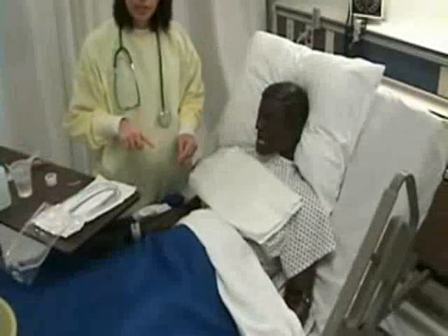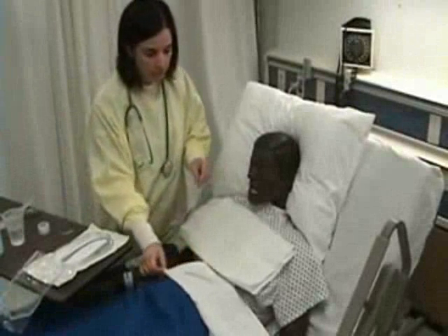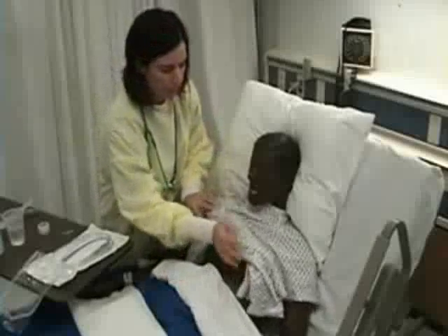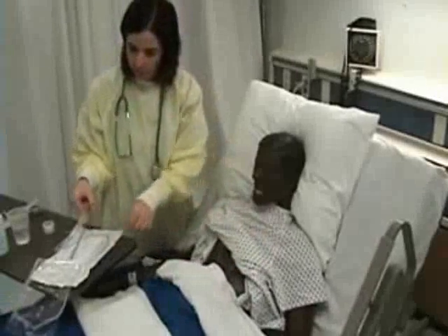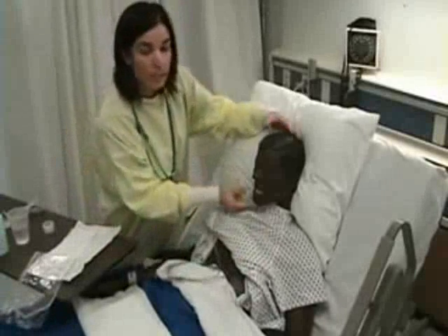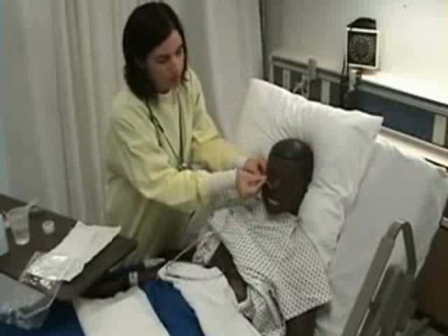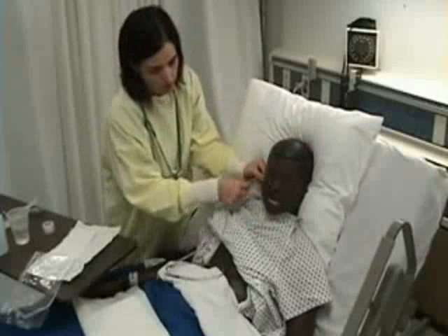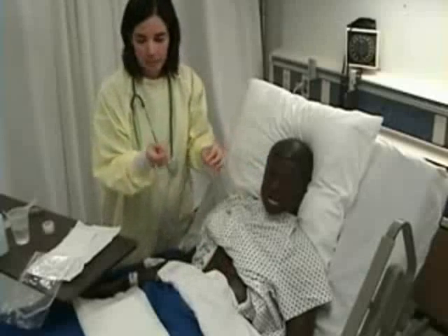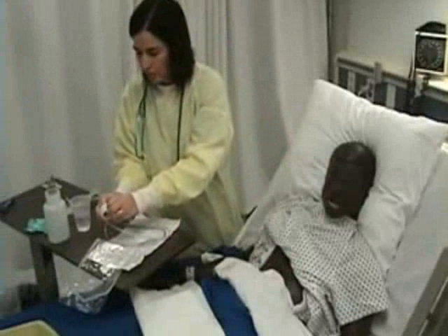I must measure my NG tube so that I will know how far to place it. I will do this by pulling up this gown. I'm going to measure the tube, and I'll turn his head slightly for demonstration, from the tip of the nose to the tip of the earlobe to the xiphoid process. At this mark, I will put a piece of tape, and that will tell me how far to insert my NG tube.